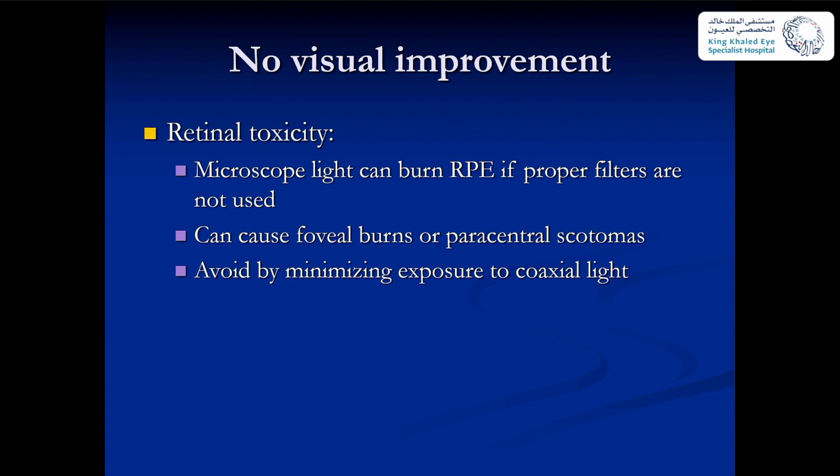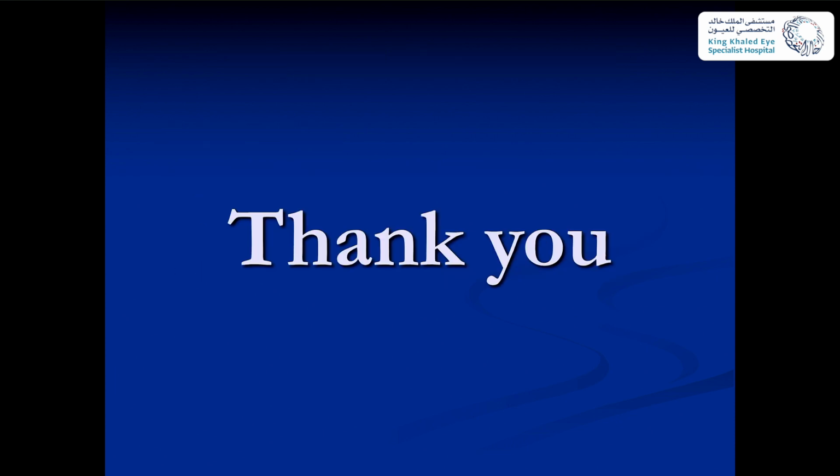Then there is no visual improvement. We did the surgery, and after that, the patient didn't improve. In the absence of any organic cause, retinal toxicity can be a cause. Microscope light can burn the RPE if proper filters are not used, and can cause foveal burn or paracentral scotoma. Avoid or minimize exposure to coaxial light. The microscope has a diffuse light illumination and coaxial light. So whenever you are not using the coaxial light, you can turn it off, especially if you are anticipating that you will take a longer period of time, to avoid this phototoxicity.